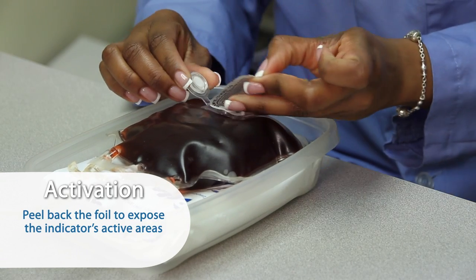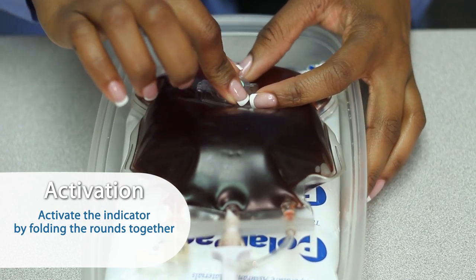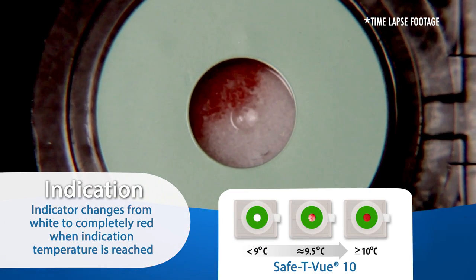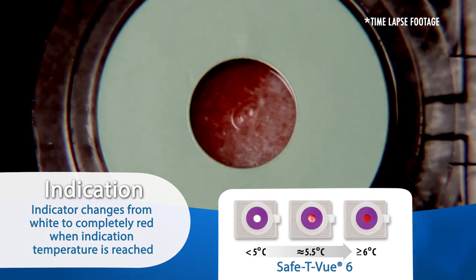Peel back the foil to expose the indicator's active areas. Activate the indicator by folding the rounds together until it snaps shut. The indicator will gradually change color from white to completely red when the indication temperature is reached.